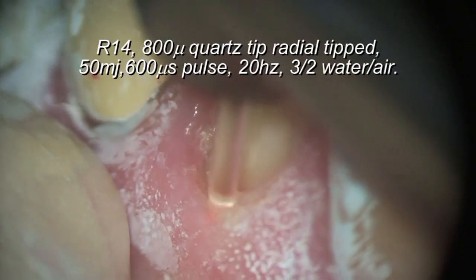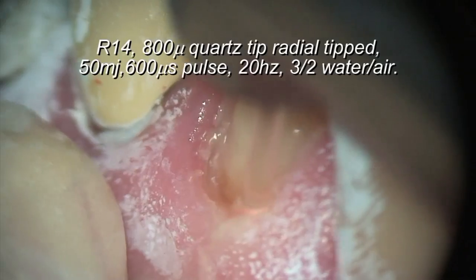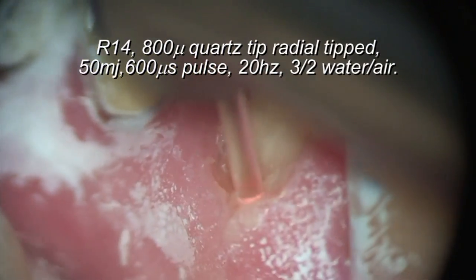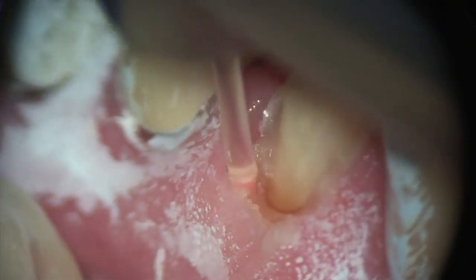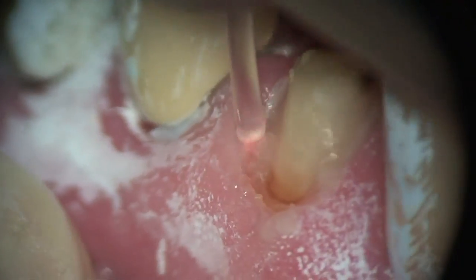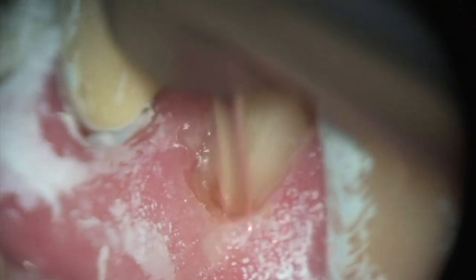One of the other functions of the Erbium laser is utilizing the tipped handpiece, or the R14 handpiece. You can do all sorts of other types of operations. In this case, you can see in contact, I'm actually creating a trough around a crown margin. I had removed a porcelain fused to metal crown that was previously placed on this tooth, and I needed to remove some tissue without removing tissue height to just expose the margin.